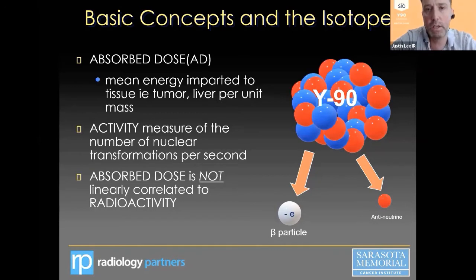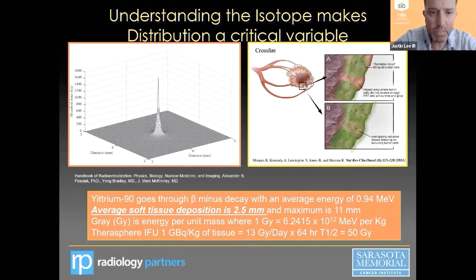And you really don't get a chance to control absorbed dose. You control the activity because you tell your nuclear medicine people or whoever's drawing up the dose, or in the case of glass, whatever vial you're going to order and decay it to, you're controlling the activity, but really you don't have much influence over the absorbed dose. And the reason for this is this drawing that was already shown by Chinu in his talk, which is that the isotope, in terms of its effective radiation, is actually really centered along the isotope. And as we get further and further away, we're really getting insignificant amounts of radiation.